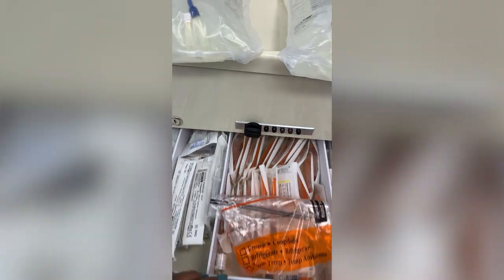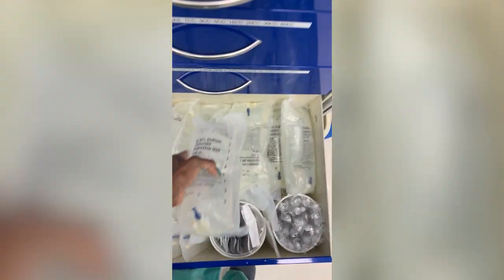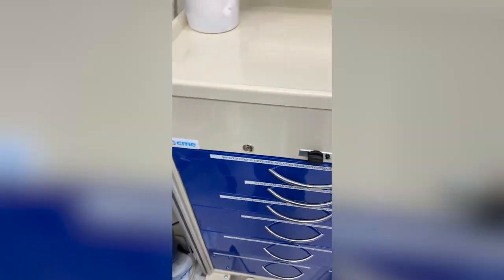So those are our IVs. And everyone that has anesthesia gets one. So don't be nervous about that, placing the IV or getting an IV placed, because it's really the only way that we can take care of you safely.